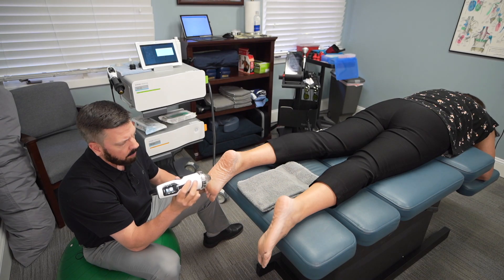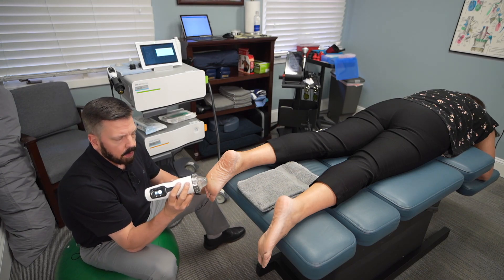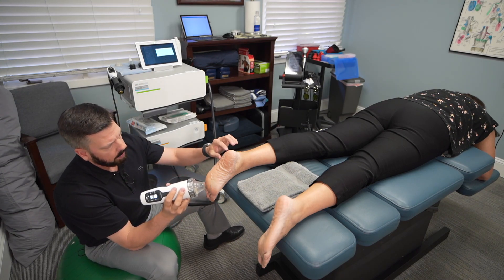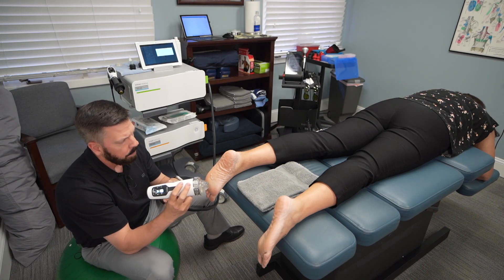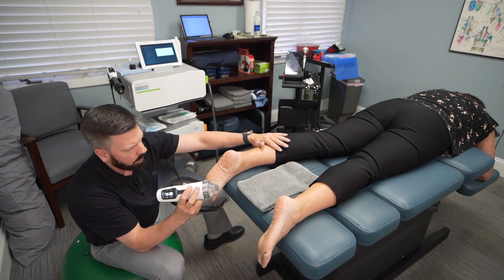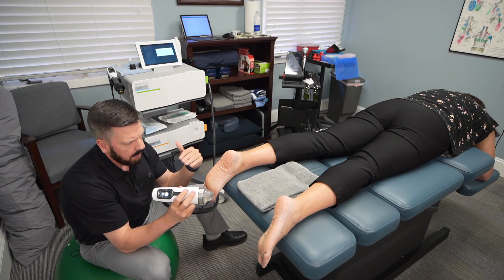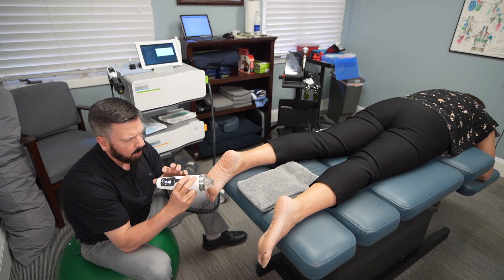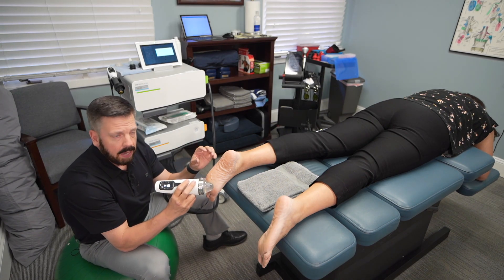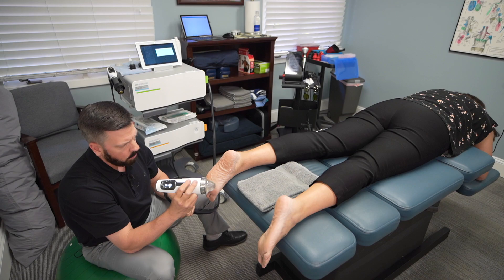There is another type of shockwave called radial shockwave. The difference is that focus shockwave gets much deeper, so on an area like this where we need to penetrate very deep into the tissue, focus shockwave works better. If I'm treating a muscle belly in the calf, that's when radial shockwave can also be effective, but it's more superficial. Make sure when looking up a provider that they do have focus shockwave — radial shockwave can be used in this area but it's just not as effective.